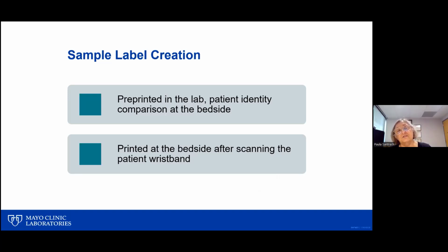Now, sample label creation, there are 2 approaches to this. One is that you pre-print the labels in the lab, and the phlebotomist goes out with the labels, and then does their rounds and collects the samples that they need to.